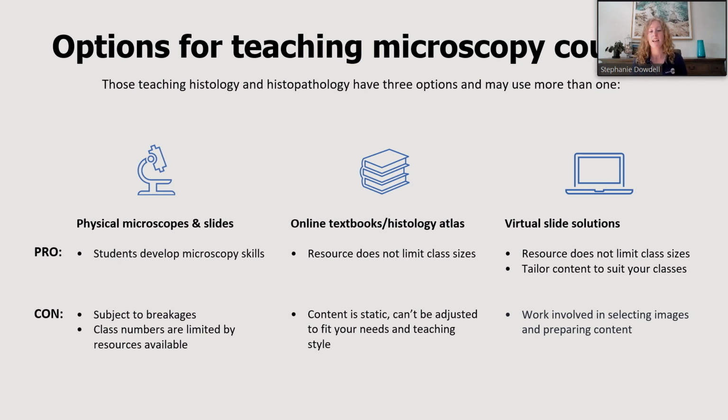Then we have our online textbooks and histology atlases. Luckily, these resources do not limit class sizes, and the con is that content is static and can't be adjusted to fit your needs, your teaching images, or your teaching style.